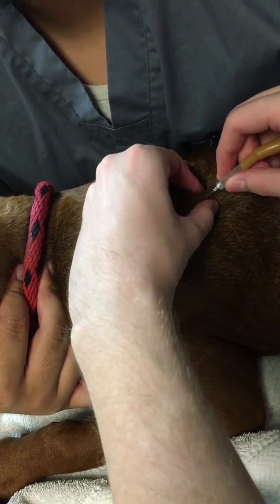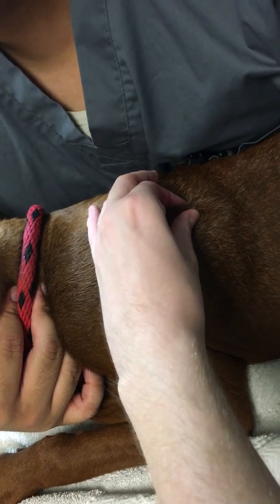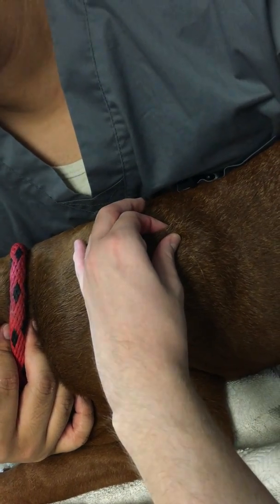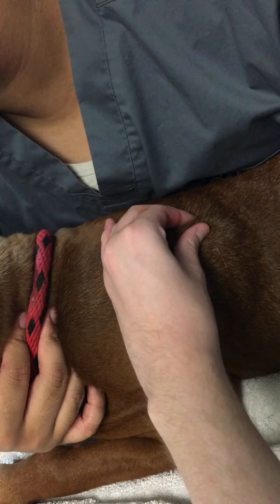You're just gonna pinch the spot just below and you're just gonna pull it out. Keep pinching, otherwise everything is gonna start to leak out. It's normal if a little bit leaks out, but you do want to try and avoid that as much as possible.